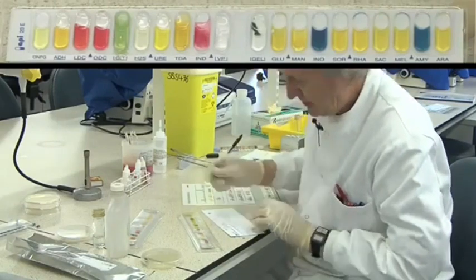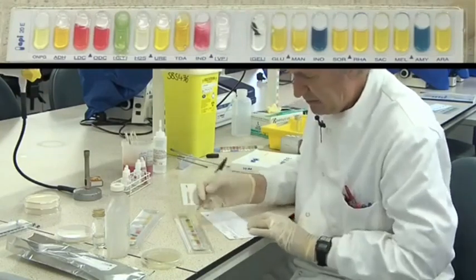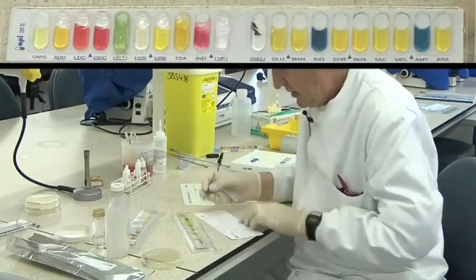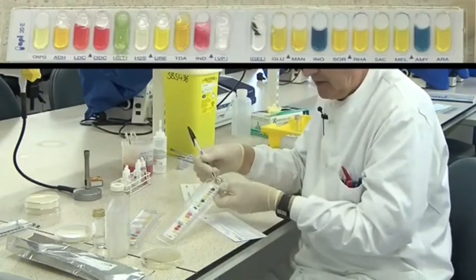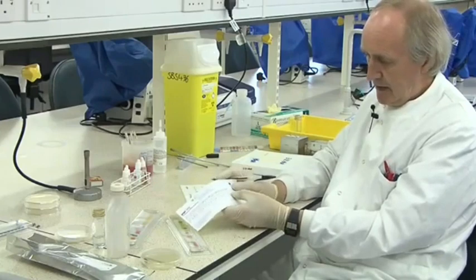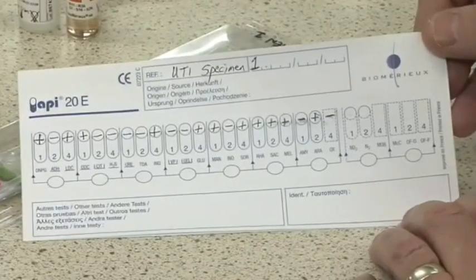We would expect glucose to be positive, because if it isn't it's not an Enterobacteriaceae. Glucose is positive, mannitol is also positive. Inositol has stayed blue — the sugar goes yellow if positive, so that's a negative. Sorbitol positive, rhamnose positive, saccharose, melibiose. Amygdalin has stayed blue, so that's a negative. And arabinose, the last one, is positive. Prior to using one of these strips — they're relatively expensive — we would have done an oxidase test, and that would come out negative if it's a true Enterobacteriaceae, so I'm going to put negative there. So we've got the result — better put strain 1, our name, and all that.